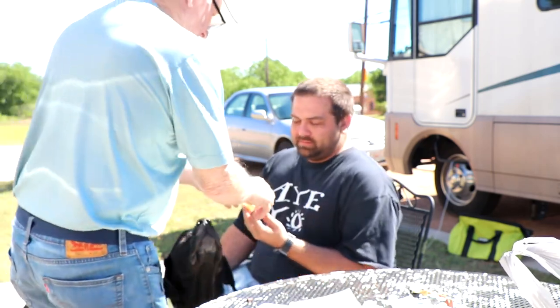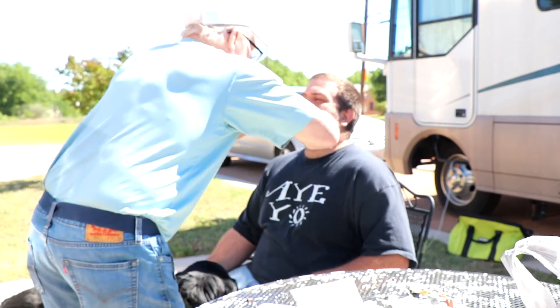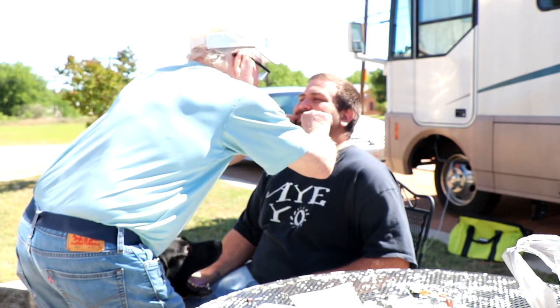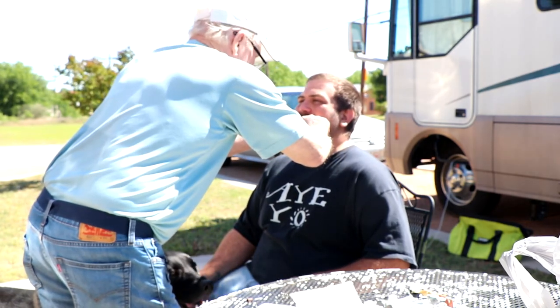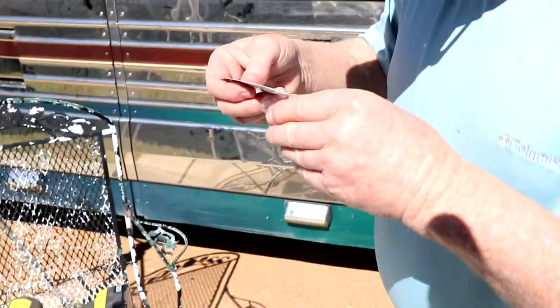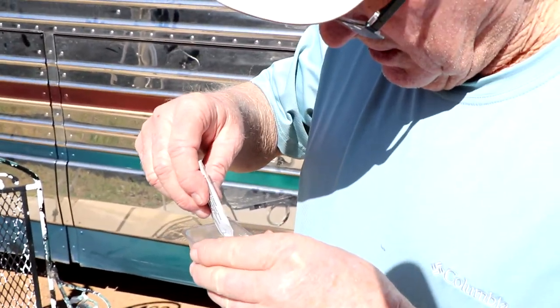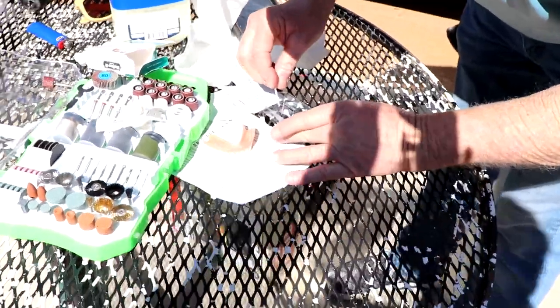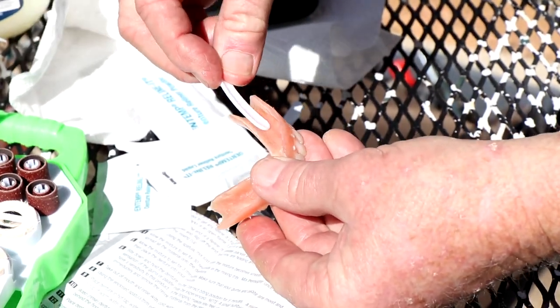Let me see how your teeth are doing. What I'm doing here - I'm putting the liquid in a little container. Before we put the liquid on, we're going to use this tool right here to etch the surface of the acrylic.